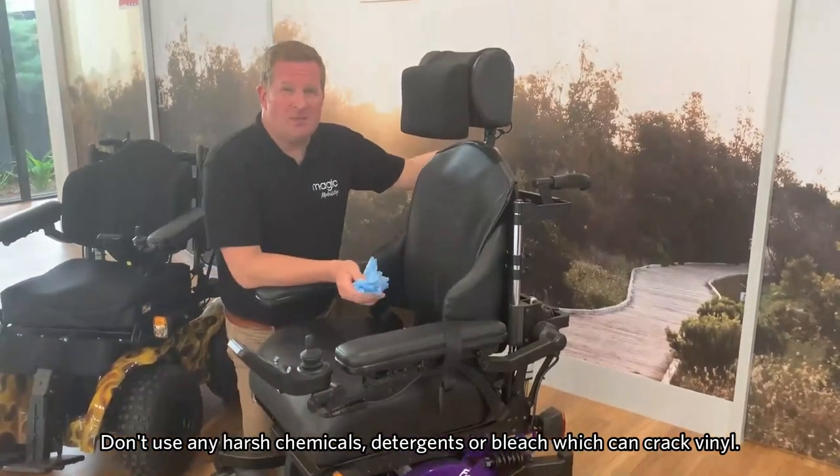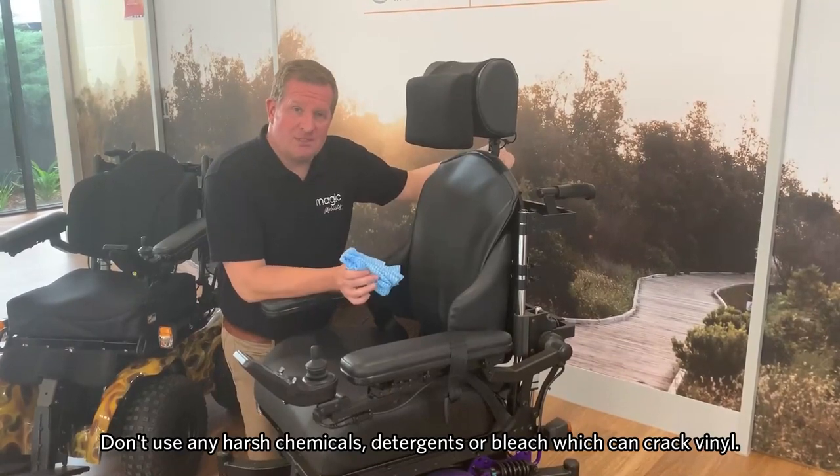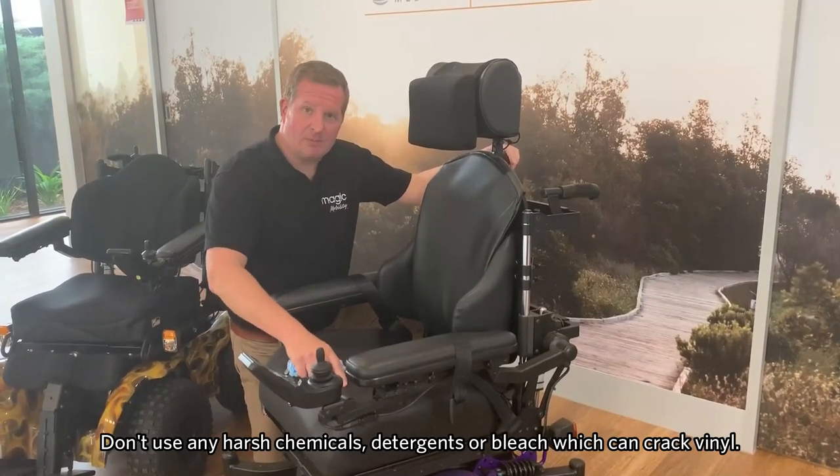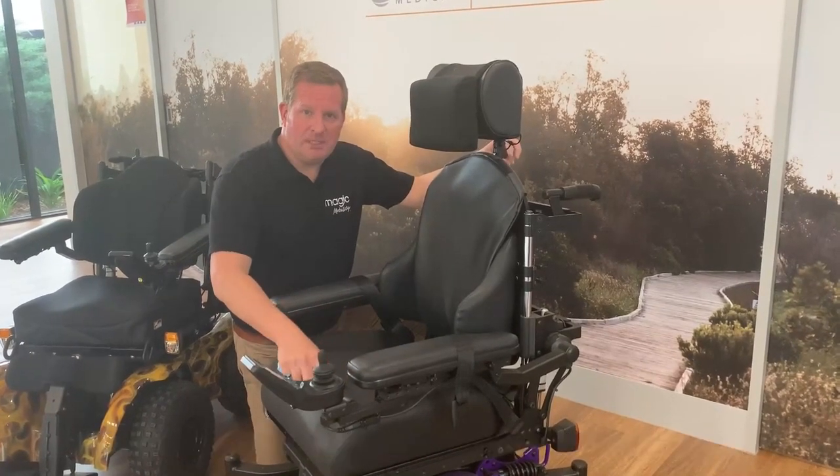Be careful not to use any harsh chemicals, detergents, or bleaches, because they can wear the materials and make them crack.